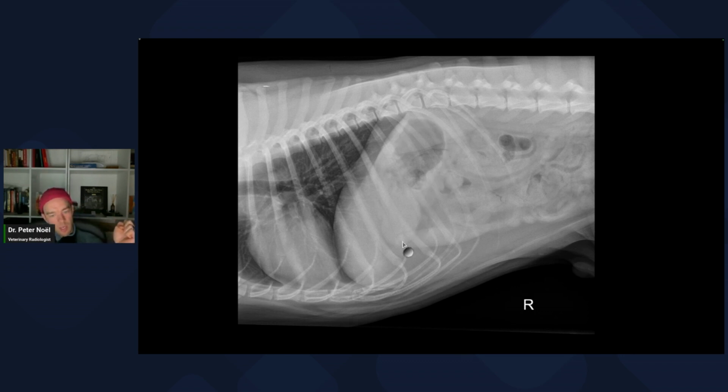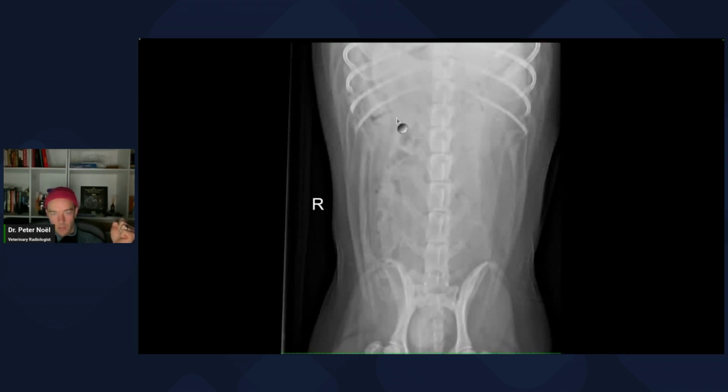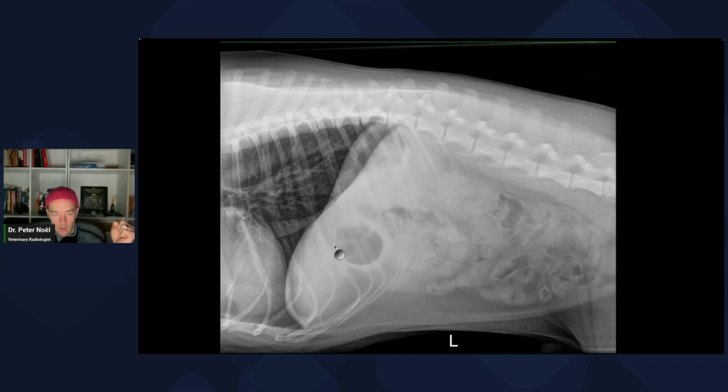This is the stomach right here, right lateral view. It's got fluid in the pylorus, or it's empty and the pylorus is collapsed, and gas in the fundus. Okay, so this is only a mildly distended stomach. And then left lateral view, gas-filled pylorus. This is probably the duodenum, but I kind of lose it. So the stomach is only mildly distended with a little bit of fluid and a little bit of gas.